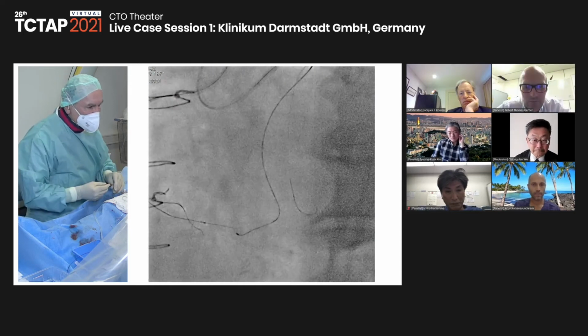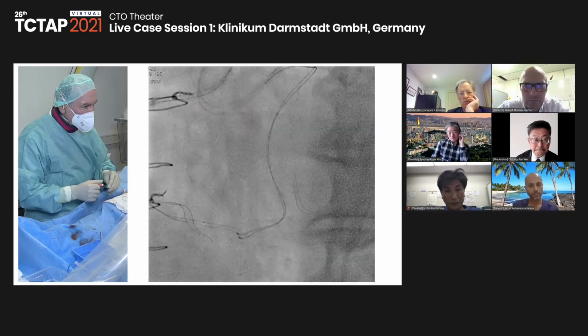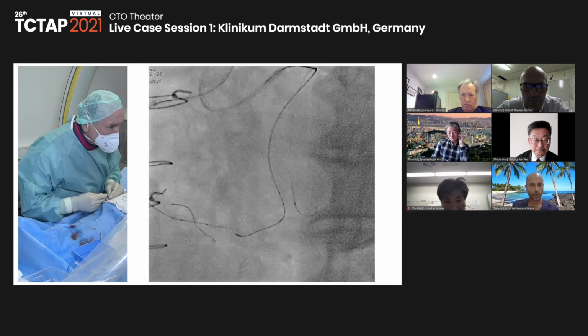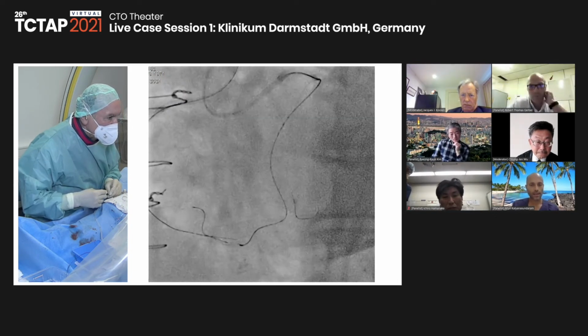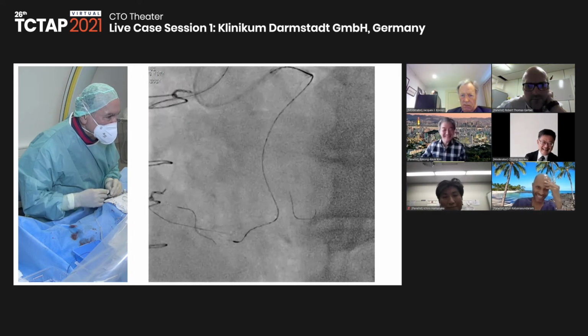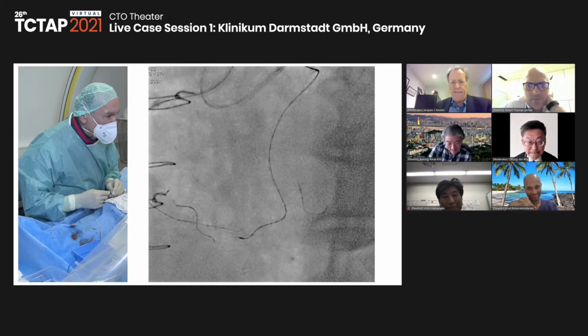No, it doesn't. So I lost the position here. Now I'm here again. There is a little knuckle. Arun is happy. Knuckle. Yeah, but that's not good, probably.